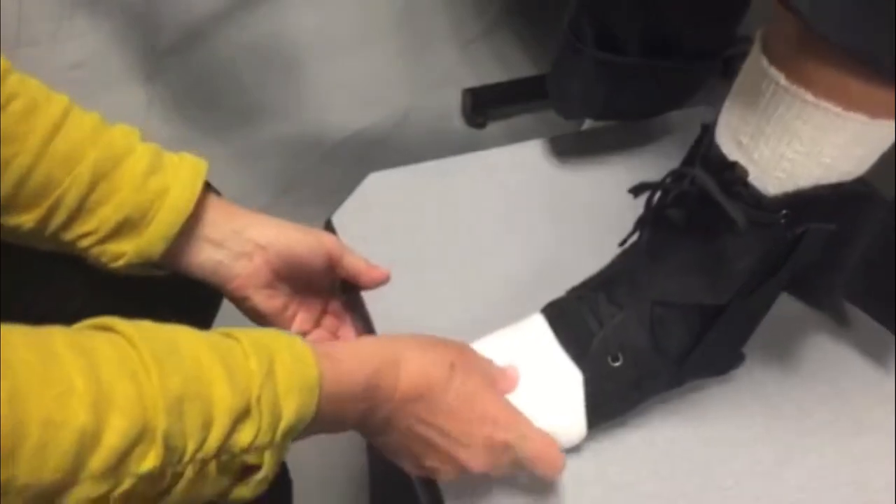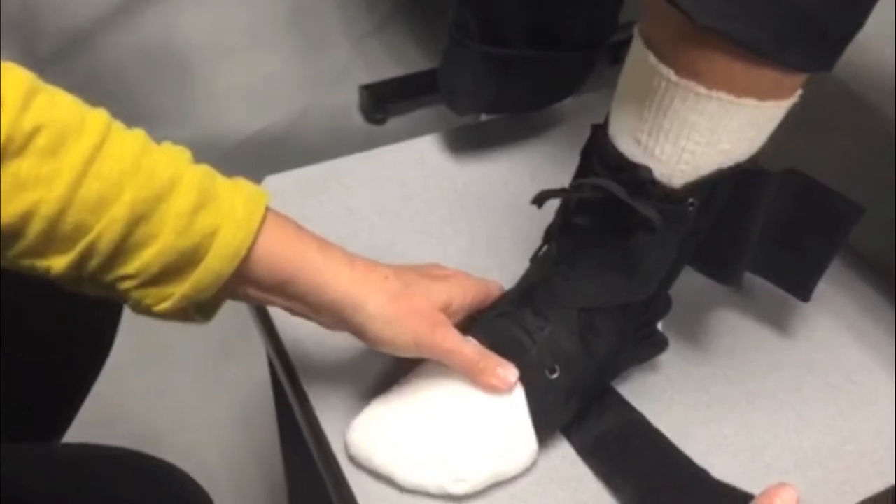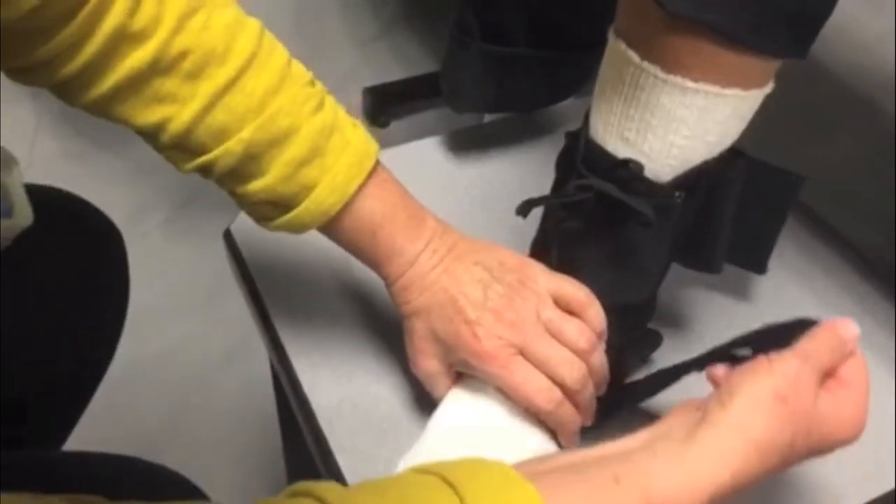With your foot flat, release the outside stabilizer strap. Evert your ankle joint as much as possible and reattach the strap. This will help prevent a future inversion sprain.